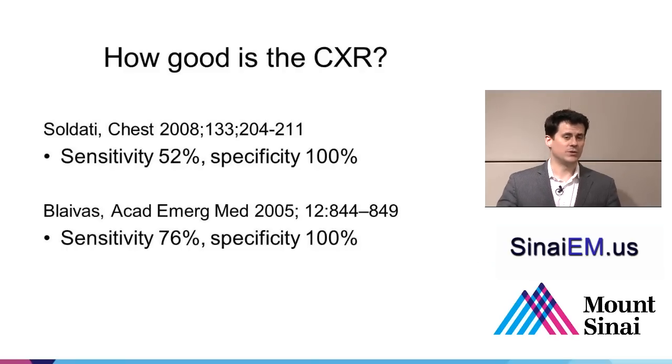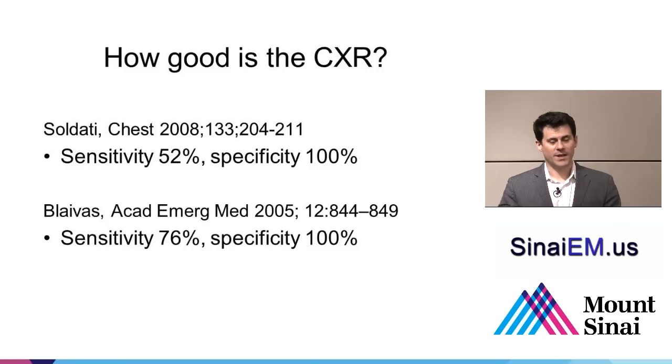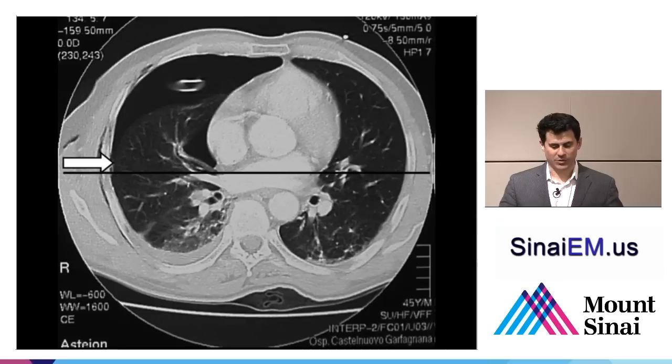It was often the best that we could do, but it's not like you sent the patient to radiology and had them do an inspiratory-expiratory film and do a real good assessment for pneumothorax. But we don't have the luxury of being able to do that very frequently at the point of care, so chest x-ray portably at the point of care is often not that good to detect pneumothorax.